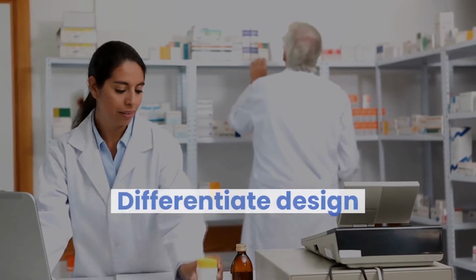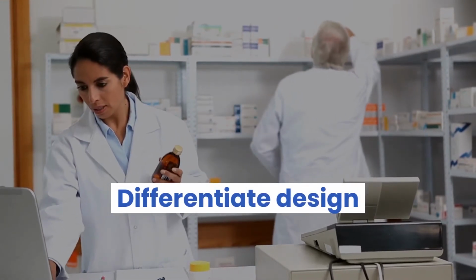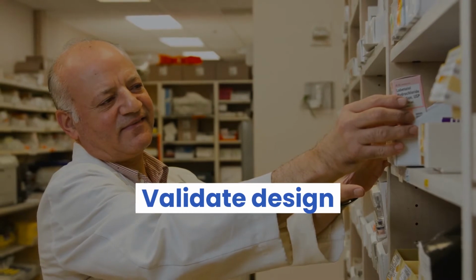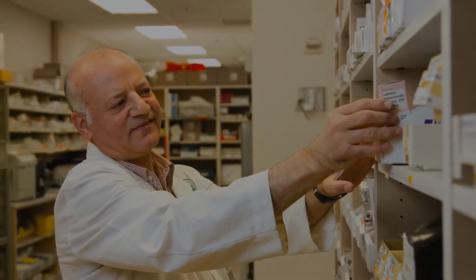Packaging is important to dose and drug differentiation, particularly in the pharmacy. Elements like use of color, shape, and text should be tested to ensure that errors are minimized. New package and label designs should also be validated. Even minor changes can impact potential for medication errors.